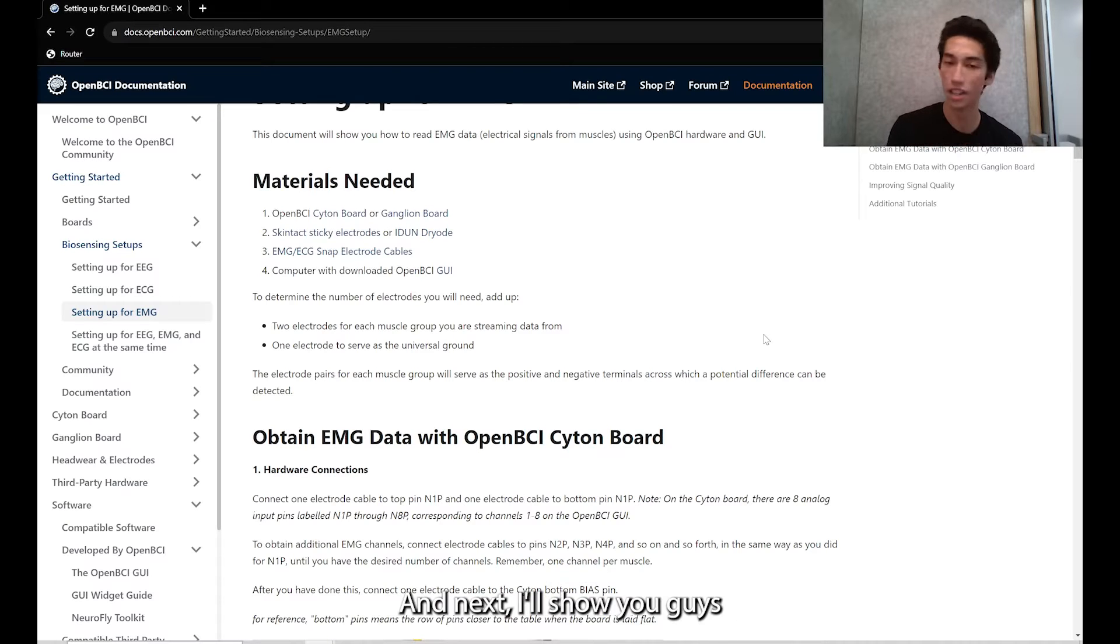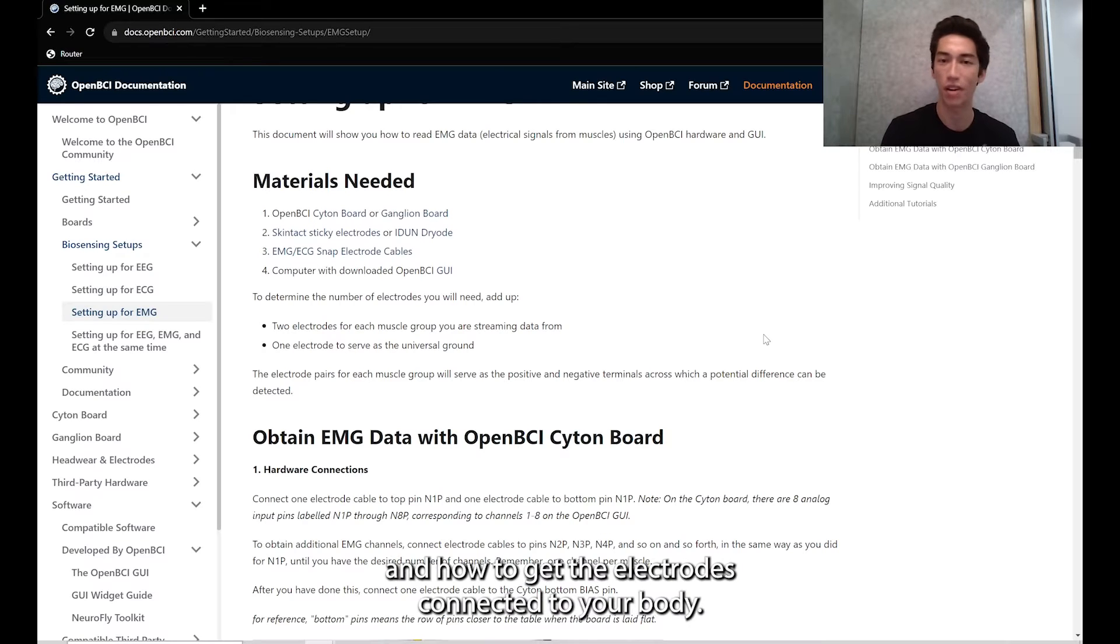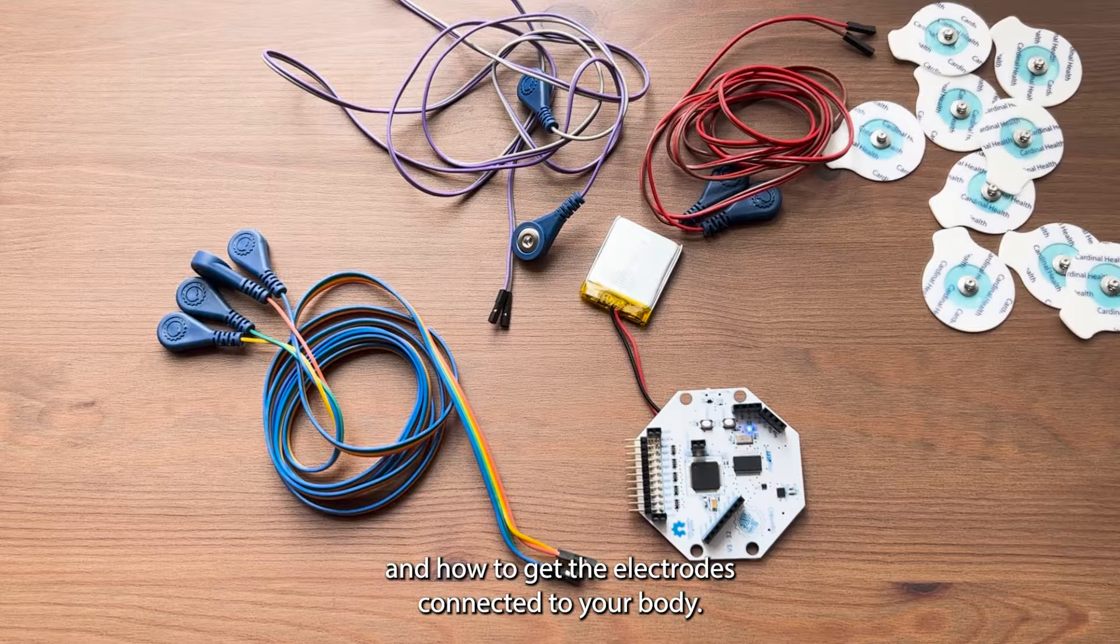Next, I'll show you how to plug these electrodes into the Cyton pins and how to get the electrodes connected to your body.